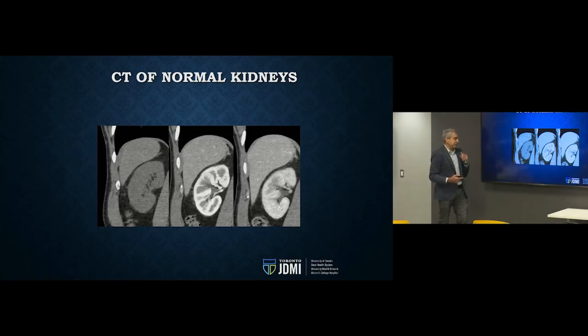And the reason for that is because X-rays in general are not very good at differentiating the different types of tissues, other than whether or not it's fatty or contains air or contains bones. So if it's devoid of lots of very hard minerals, it will appear very black, and if it's full of very hard minerals, it will appear white, and if it's somewhere in between, it will be a shade of gray. Now, for us to improve on CT imaging, we have to instill some hard, dense material, and that's the intravenous contrast that's injected.